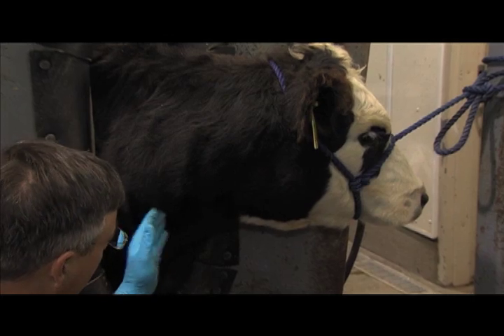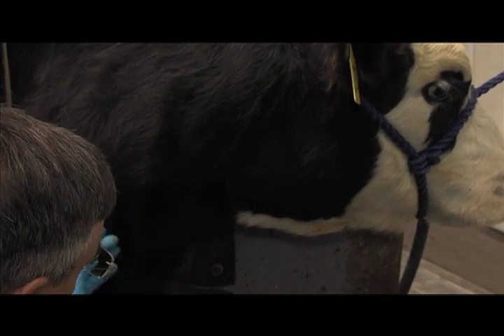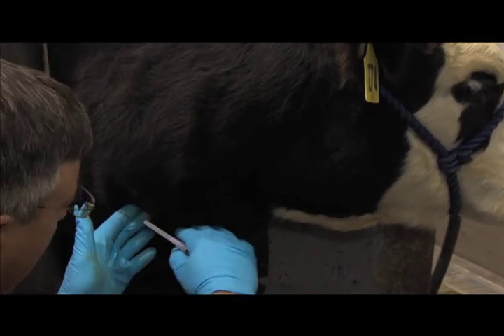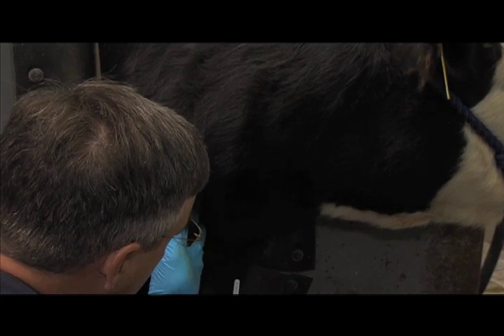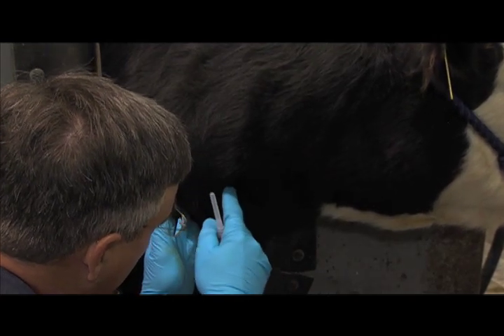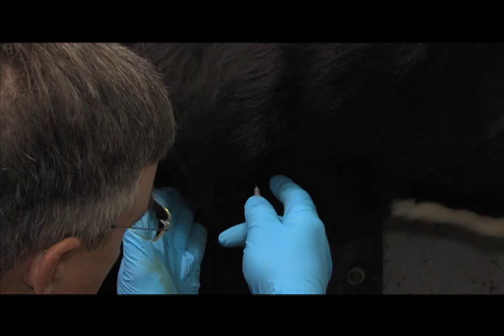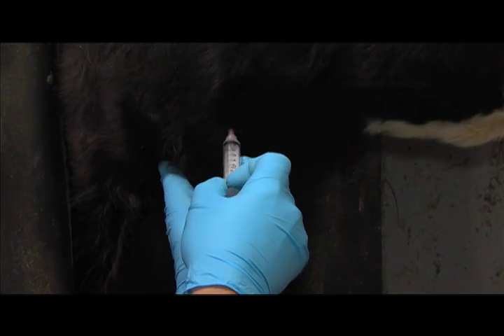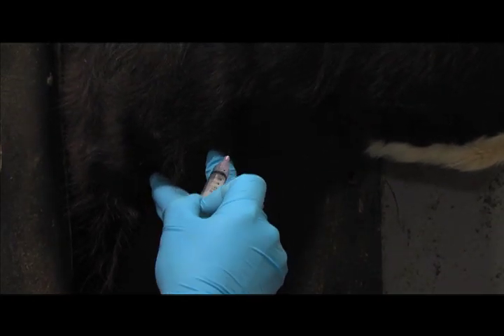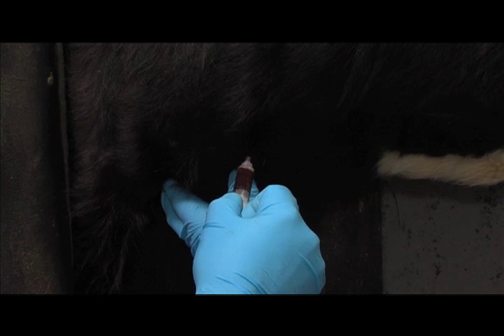Next, you'll want to identify the jugular furrow. There's muscle here, and the trachea and some muscle here, and so there's a depression in between those two areas. Take your hands and just push in that area, and you will be able to see the jugular vein pop up. It's right there. Take your syringe and your needle. Pop through, draw back. All right. And pull your sample.